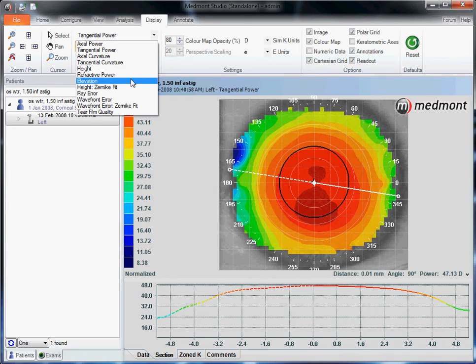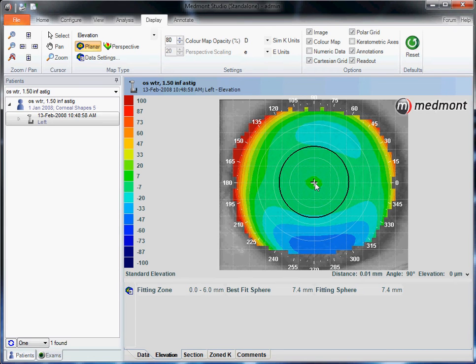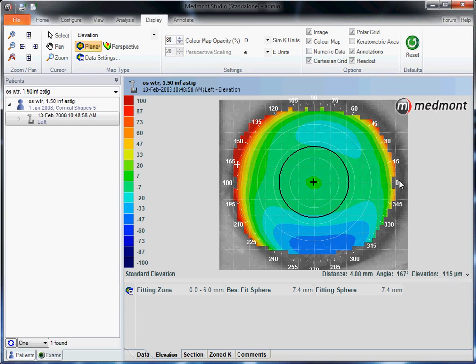We can pull up the elevation map, another commonly used topography interpretation. This tells us where the eye is high in elevation and where it's low — red is where elevation is high, blue is where it is low. Looking at the best fit sphere, 7.4 millimeters radius is the closest sphere for this eye. Based on that, at the center the surface of the sphere and the surface of the cornea are in alignment — zero elevation. However, clicking our cursor in the red, the elevation of the eye is 115 microns above the sphere; over here it's 63 microns above the sphere.